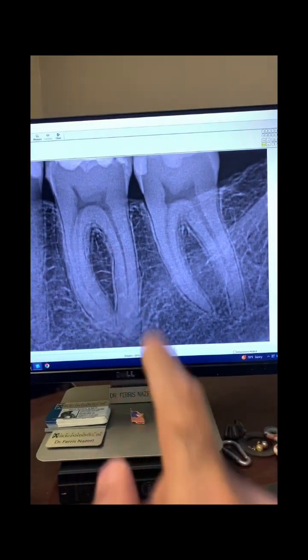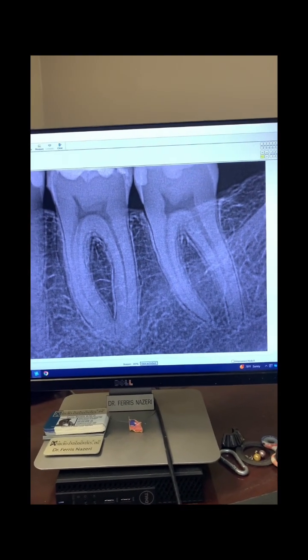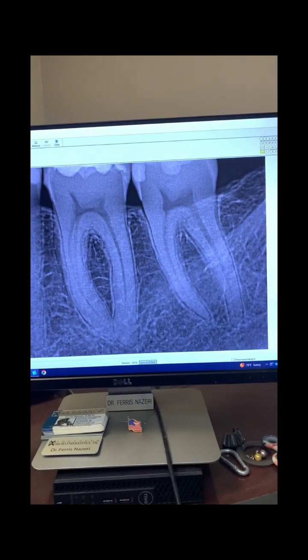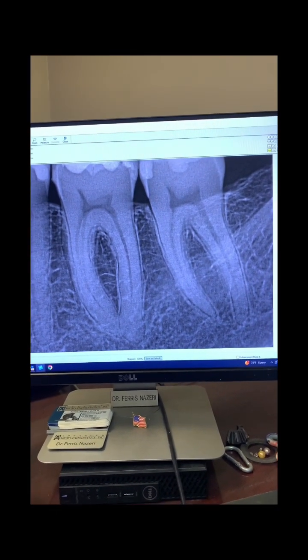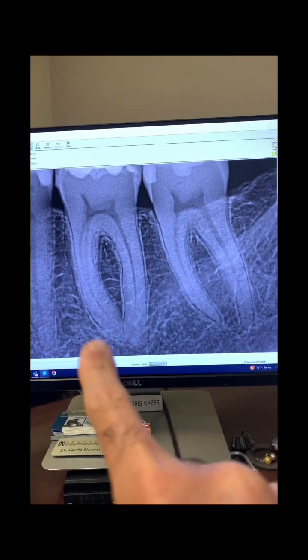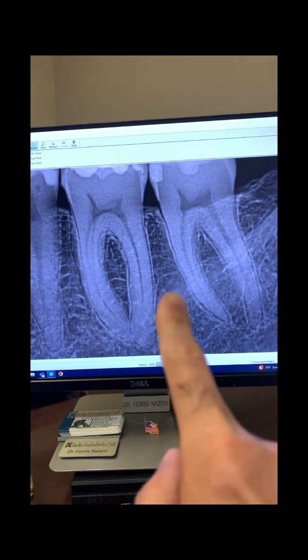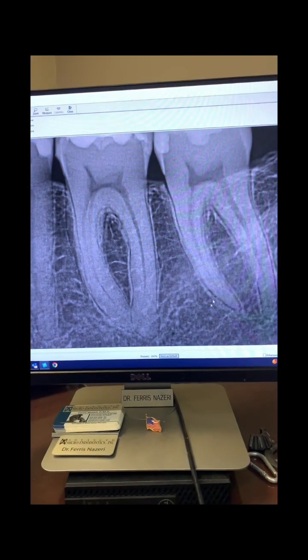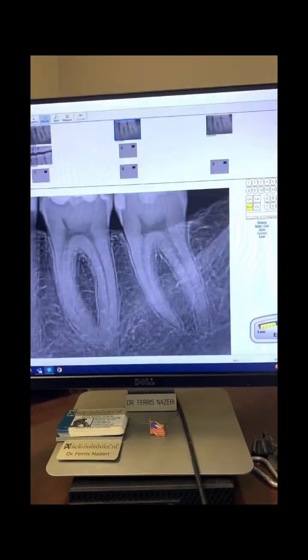Our estimated working length was 25 millimeters, and it turned out to be correct. Mesials were 25 millimeters and distals were actually 26 millimeters. And you can see the apical anatomy of these canals is interesting. So take a look here.